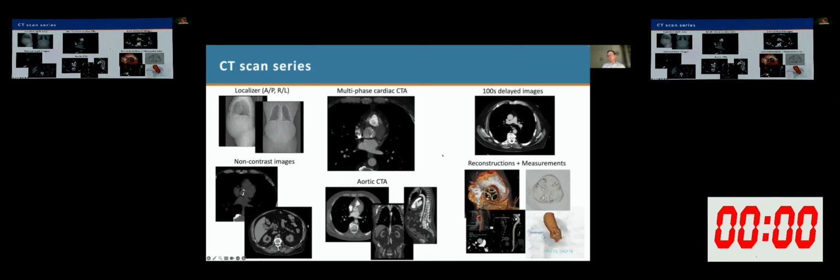We are lucky here at MGH. We have a 3D lab. This 3D lab helps us to prepare all the reconstructions we need. For example, they provide this beautiful 3D imaging of the aortic valve. They do the calcium scoring. They provide us with the angulation of the aortic root for the C-arm. And they also perform all the 3D measurements using the MPR mode and give everything in a standardized report.